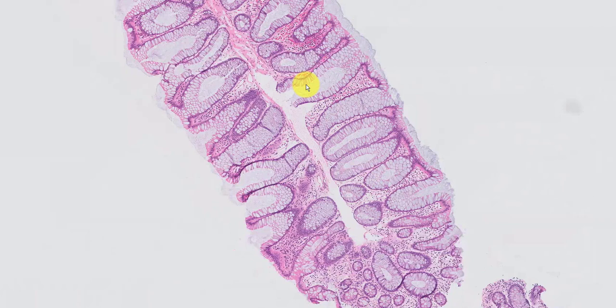Here's the polyp. These goblet cell rich hyperplastic polyps tend not to show the same degree of serration that a microvesicular variant of hyperplastic polyp will show. Does one have to subclassify these hyperplastic polyps? The answer is absolutely not.